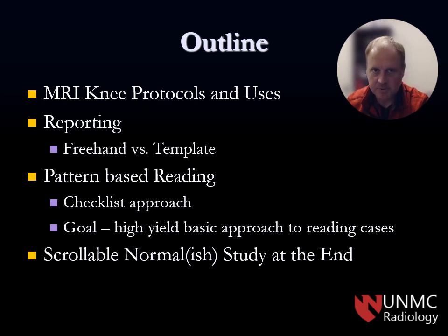At the end of this, I will put a scrollable study that you can go through on your own if you have access to the PowerPoint, which I will try to give you access to if you would like, so you can practice and go over the anatomy and look at a normal case.